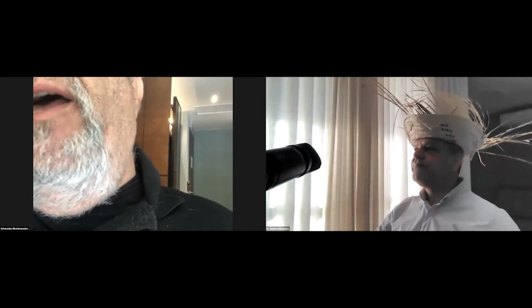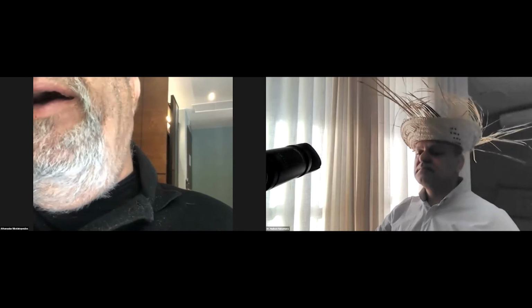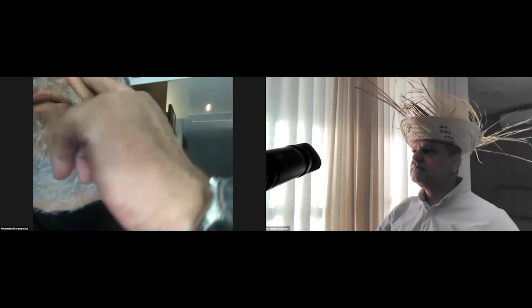The other thing is, don't try to touch anything that's sitting on top of the retina. Anything that you're touching and you want to remove, if it's a foreign body, if it's a nucleus, if it's anything else, you have to lift it into the middle of the eye, and whatever movements you're doing, don't let things sit on top of the retina. As a matter of fact, this is a very, very true thing: you shouldn't try to fish it out.